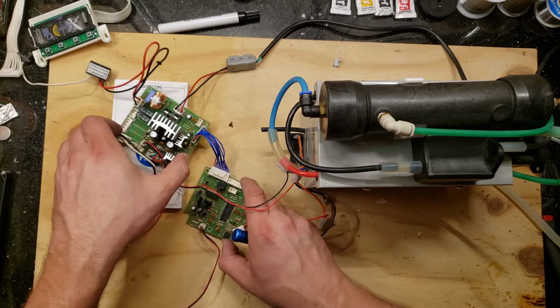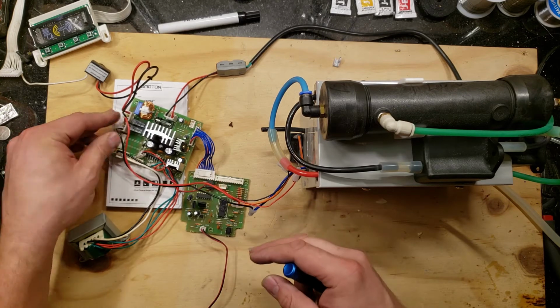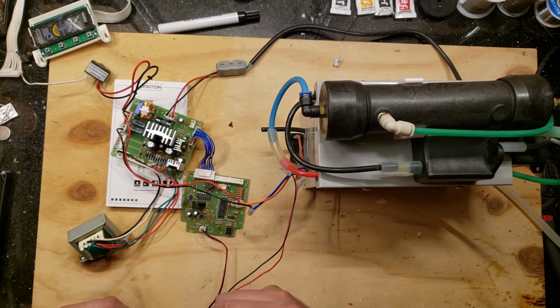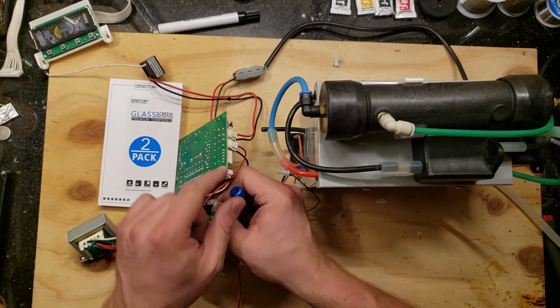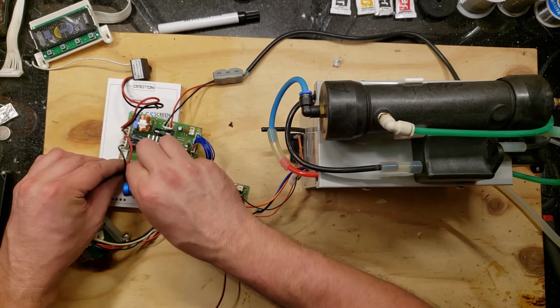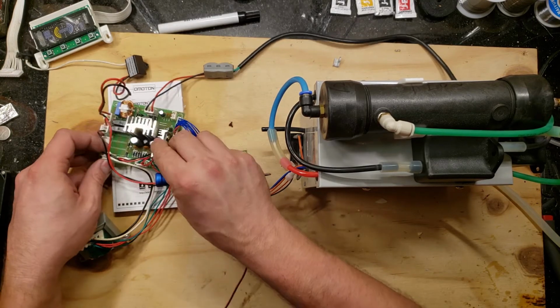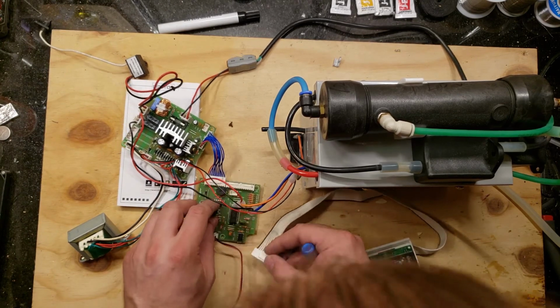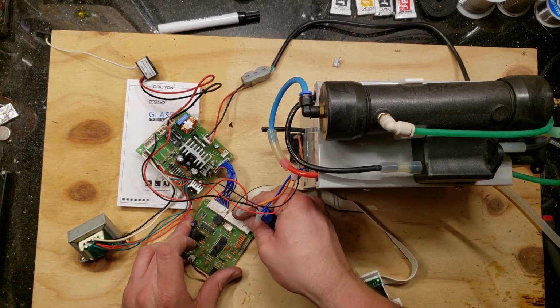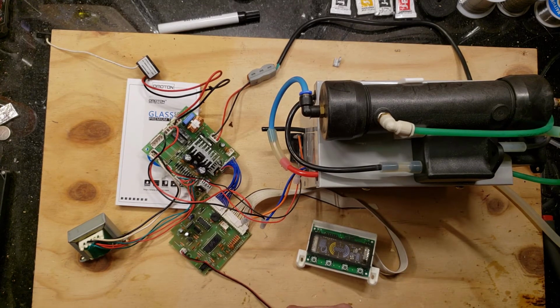So let's test and make sure this is still working properly, which there's no reason why it shouldn't be, but let's check it just in case. Oh, where was this attached? I don't know. Are these two in parallel? Yes, they are. So I guess we'll also measure. How do we make this not coin operated? I wonder how they handled it. Let's see if I start with this shorted. Is that going to enable the power button?